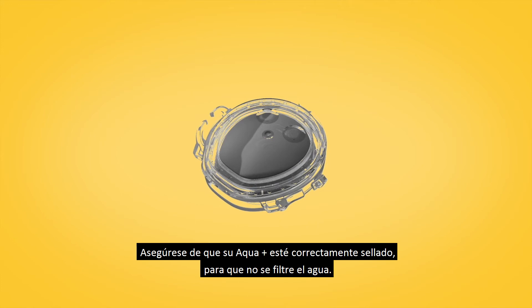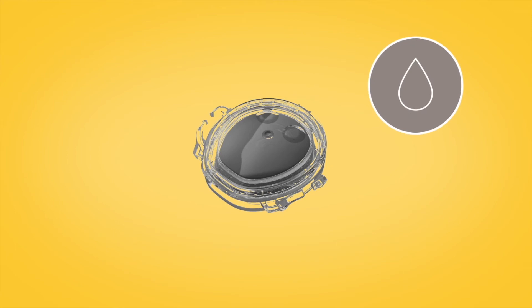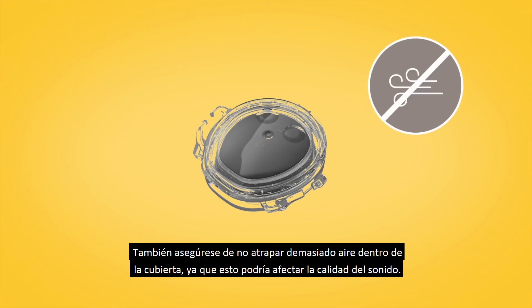Ensure your Aqua Plus is properly sealed so water doesn't leak in. Also make sure you don't trap too much air in the cover, as this could affect your sound quality.